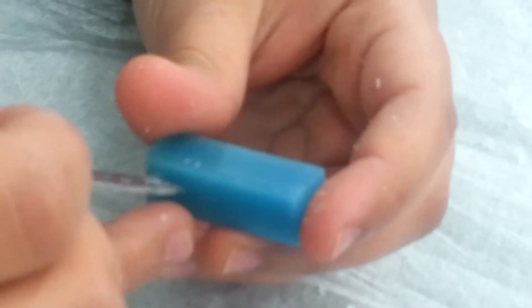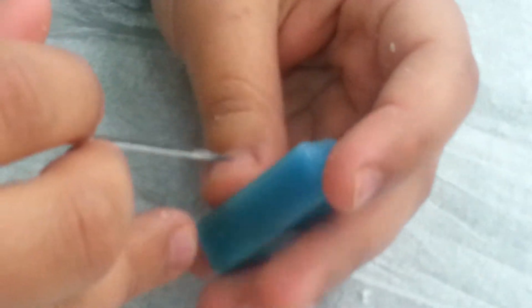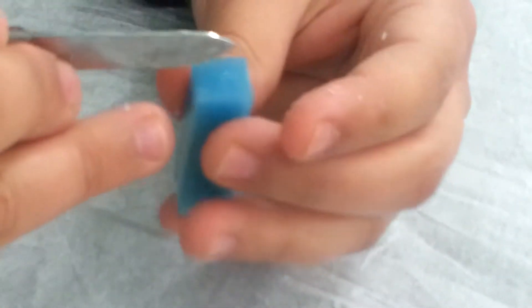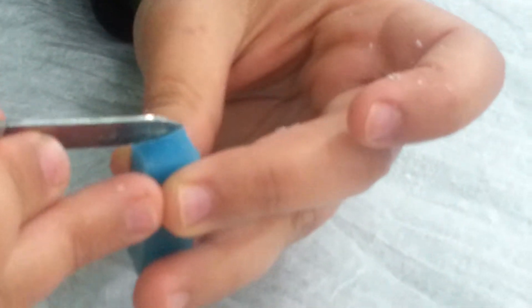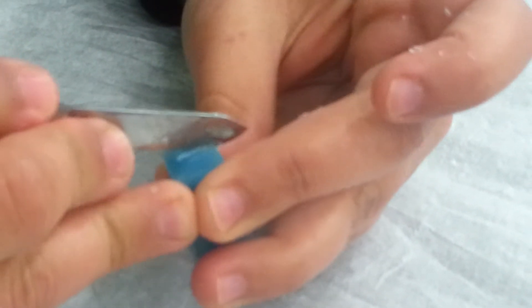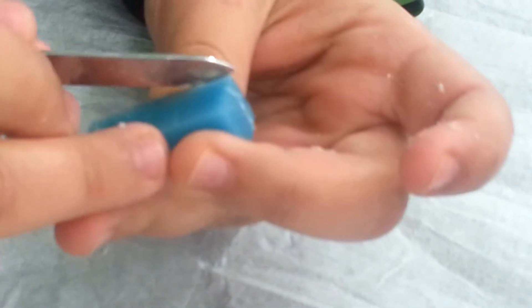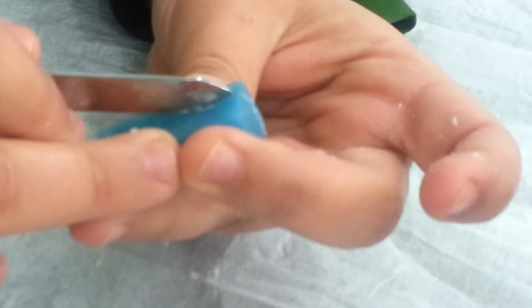Today we will do carving of upper canine on wax. We basically will use the wax knife. The first thing we will do is make a middle line with the base and wax knife. This is the middle of the sides.